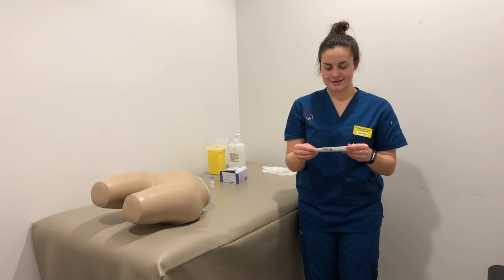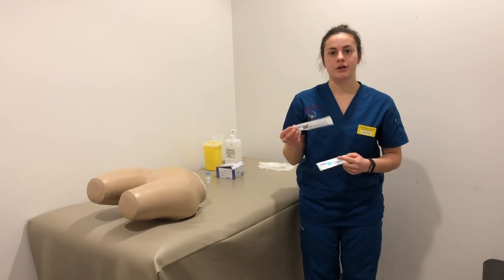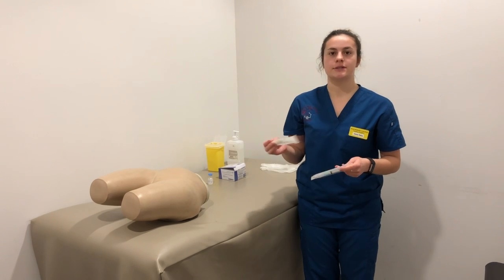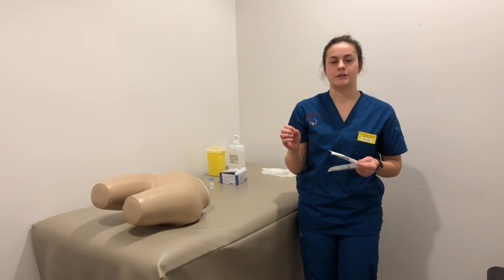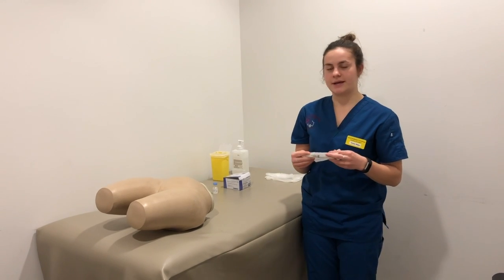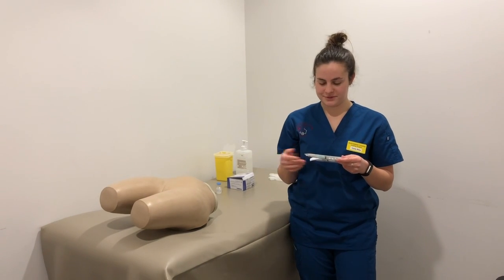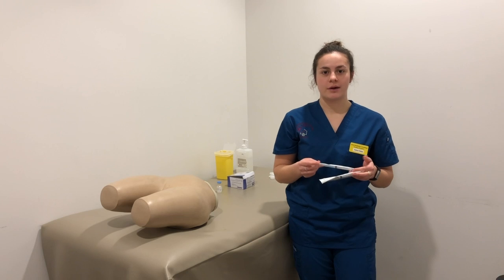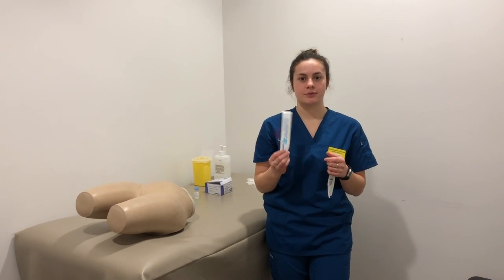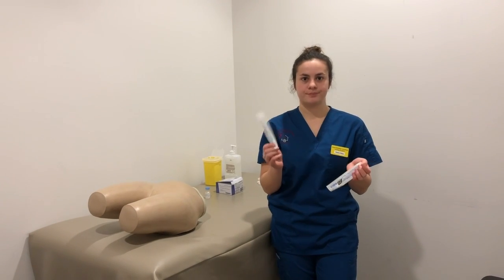So I have collected our needles for the injection. We have a 22 gauge here. That will be used for the intramuscular injection. Gauges depend on the length of the needle as well as the size, the diameter of the needle. So you'll use different ones for different techniques depending on how deep you want to go in the patient's skin. The other one we have is a 23 gauge, so that will be used for a subcutaneous injection. Typically you would use a smaller size for the subcutaneous injection, such as a 25 or 24 gauge.